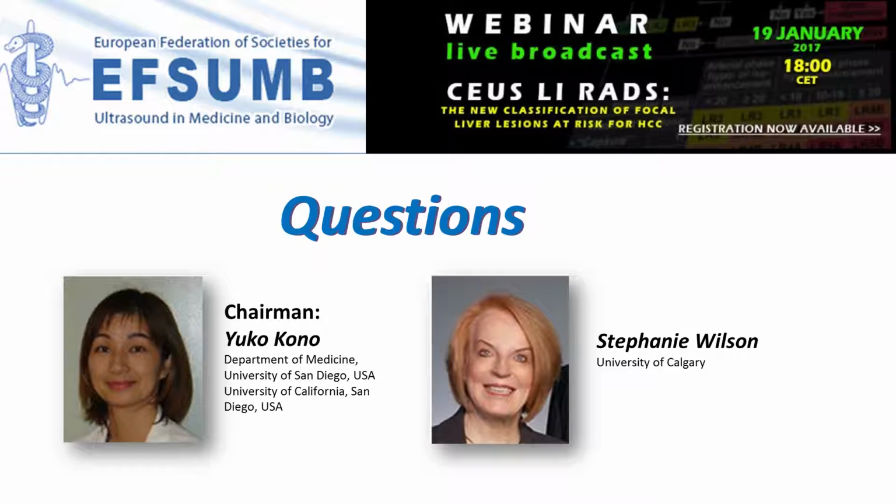With DEFINITY, we do multiple small injections of contrast. Now, with SonoVue, as it's marketed in Europe and in Canada, and Lumason now in the United States, the quantities are quite different. Perhaps Fabio might speak to that in just a moment, but I'll speak just to the other part of your question.